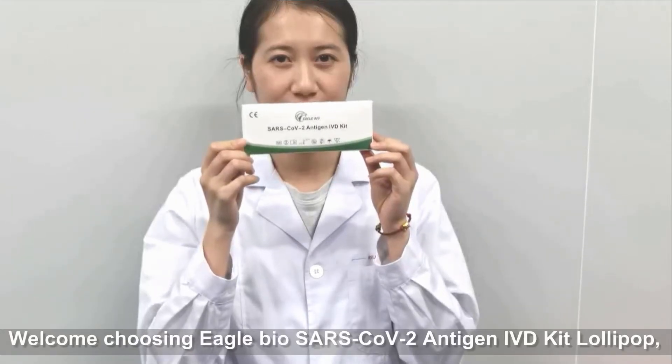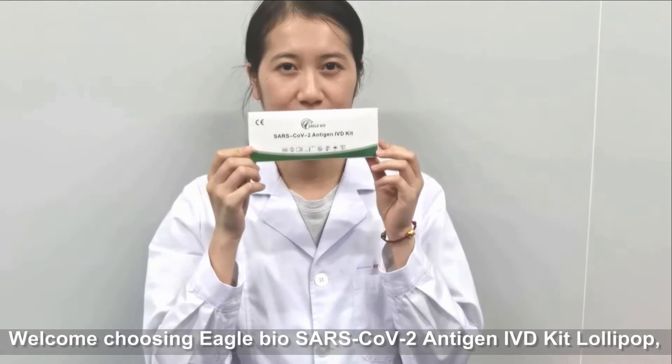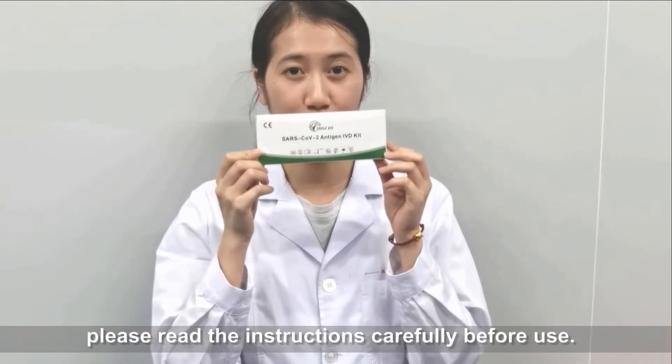Welcome and thanks for choosing SARS-CoV-2 Antigen IVD Kit Lollipop. Please read the instructions carefully before use.